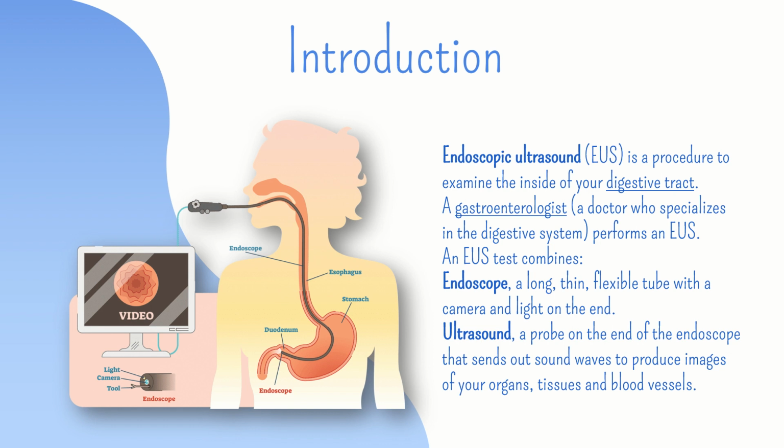This camera is used to capture the inside images of our digestive tract. On the end of the endoscope, a probe is present known as ultrasound. This ultrasound sends out sound waves to capture the images of our organs, tissues, and blood vessels.